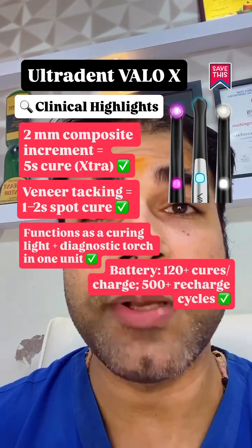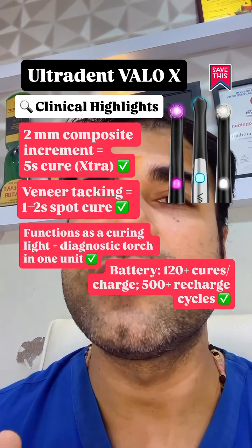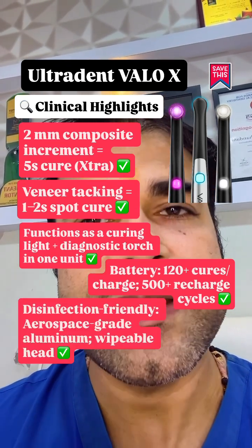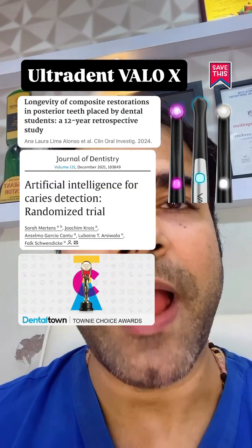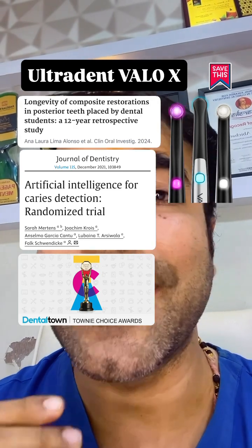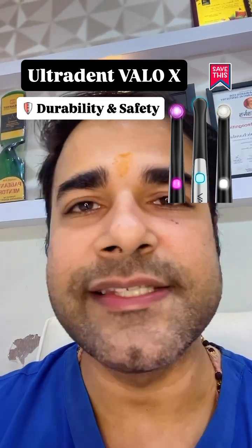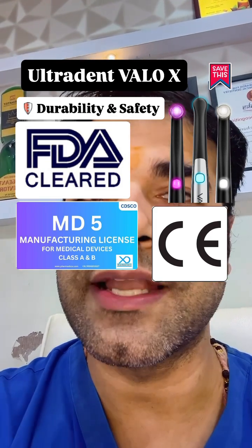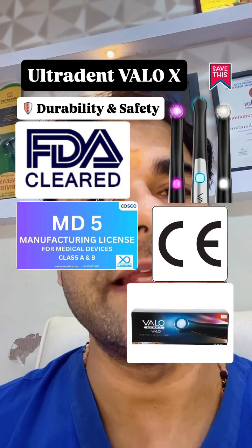Battery delivers 120+ cures per charge with 500+ recharge cycles. Disinfection-friendly aerospace-grade aluminum has a wipeable head. It is backed by science with multiple articles proving its excellence. CE marked, FDA cleared, and CDESCO registered Class B. Comes with barrier sleeves and shields, and a 5-year warranty.